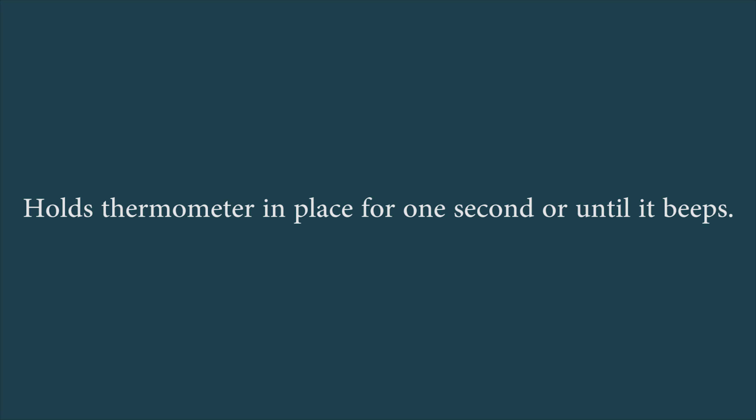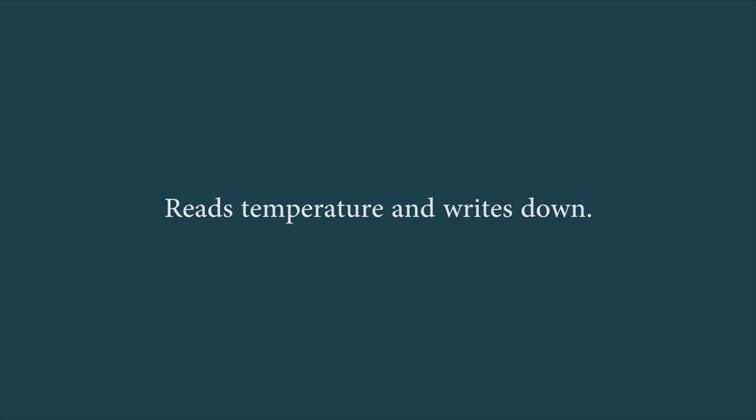Holds the thermometer in place for one second or until it beeps, reads the temperature and writes it down.